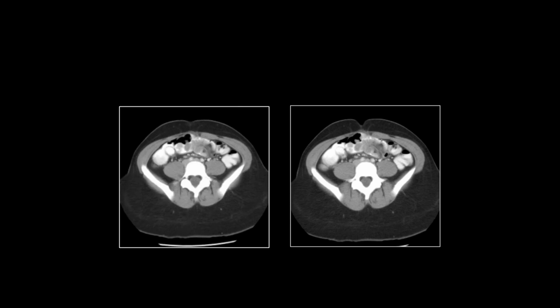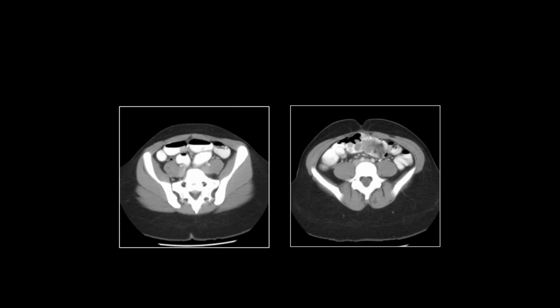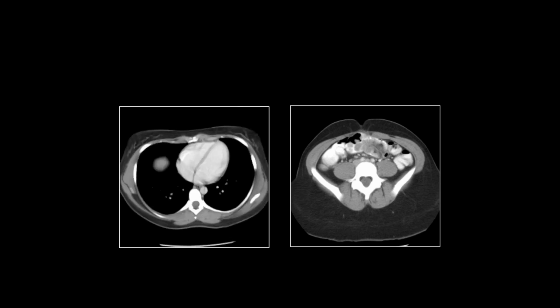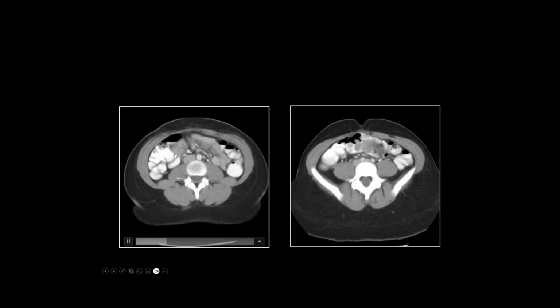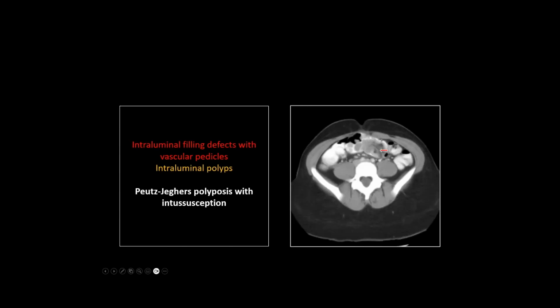Okay, well, I'll start you off on this one with multiple intussusceptions. Right, there are probably at least 3 intussusceptions here. The most prominent ones are right abdomen, which you'll see right here, right there, went past, right there. All right, there's the stalk. You've got mesenteric fat and probably a vascular pedicle there and a soft tissue mass right there. And then there's the big one right there. Look at that fatty vascular stalk sticking into the bowel lumen, and look at all those polypoid masses there.